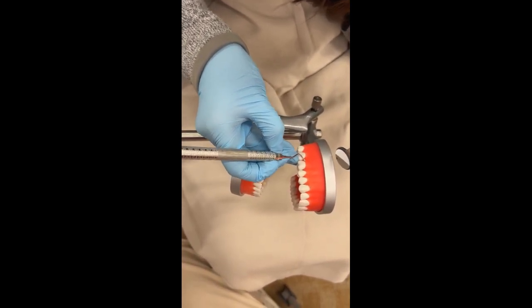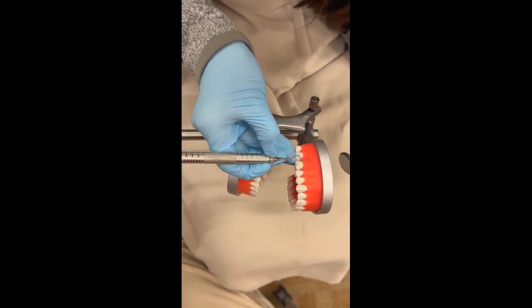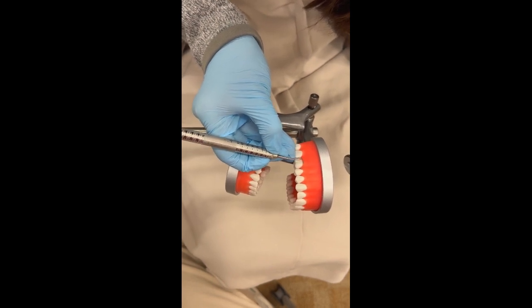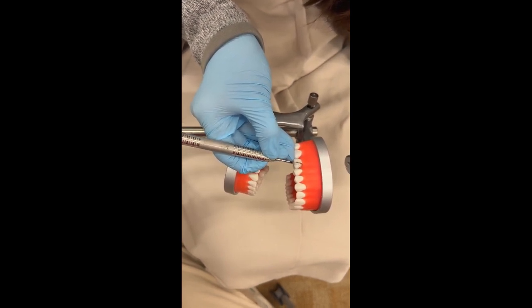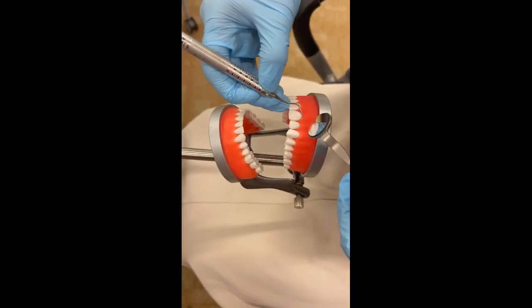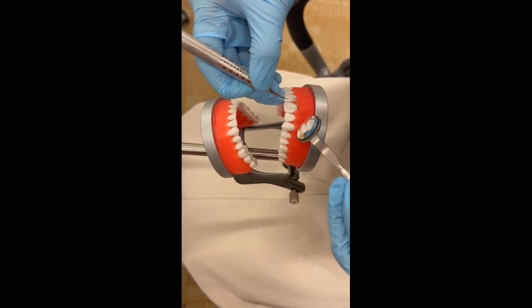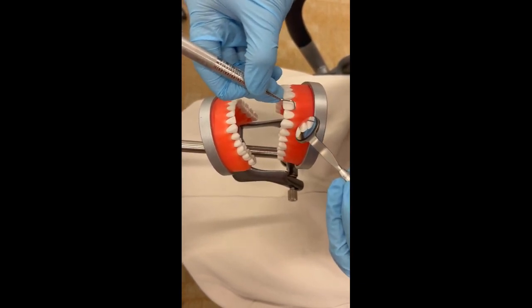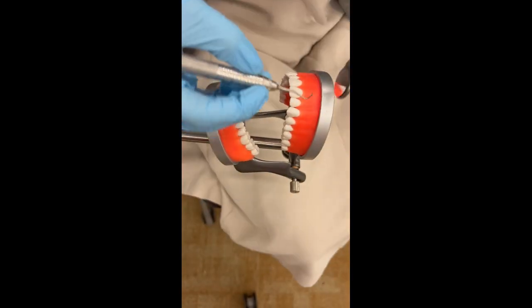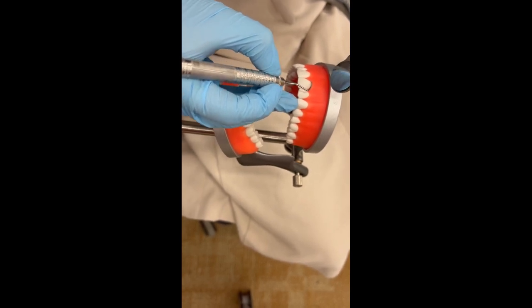For posterior teeth, you want to begin at the distal line angle of the most posterior tooth. Direct the toe of the blade towards the distal with the terminal shank angled slightly towards the tooth. Apply strokes from the line angle to contact area. Next, turn the toe towards the mesial to scale the buccal and mesial surfaces. And continue this sequence to complete the posterior region.